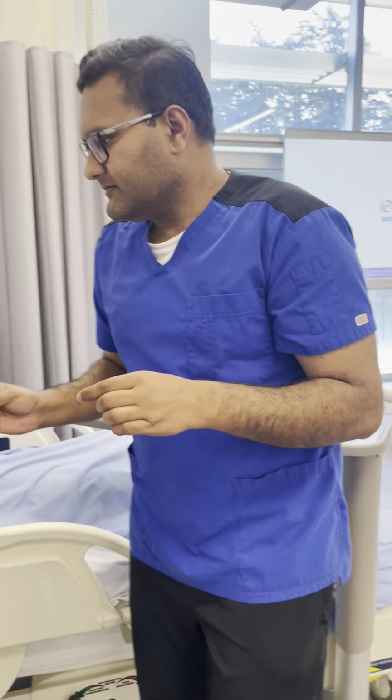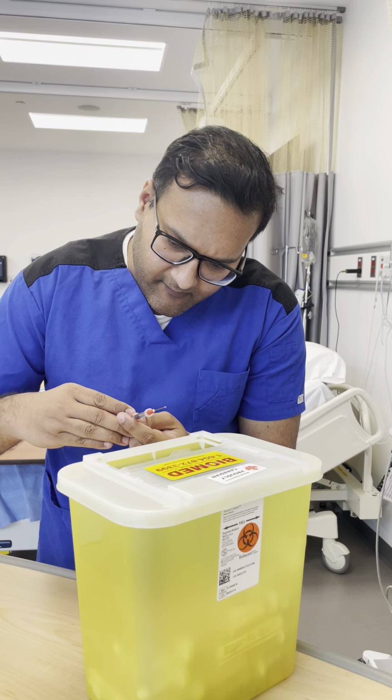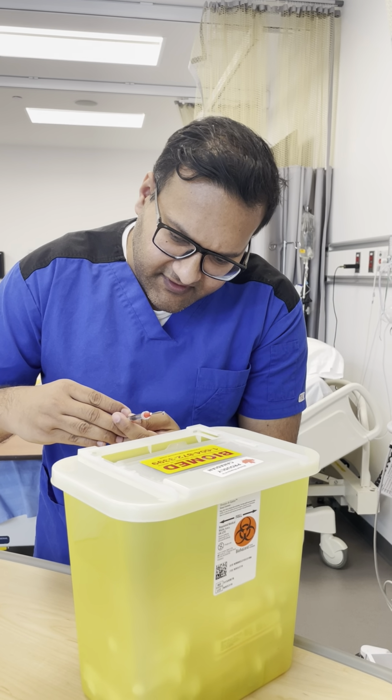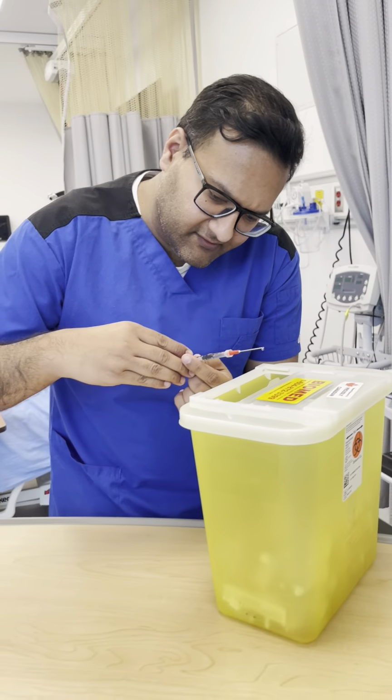So put it from the glass. I'm just going to... And I'm just getting rid of the air bubble.